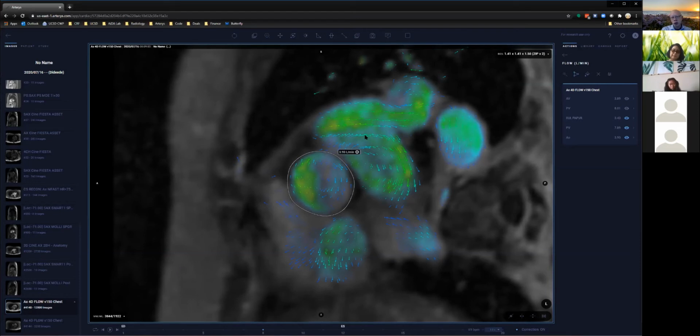It's really the measurements of shunt volume, shunt fraction, regurgitant volume that people are getting those. So I don't mind spending 10 to 12 minutes early in my scan to get a really good 4D flow, and then I don't have to worry about looking at the rest of the scan because I've got all the information that I really need. So instead of spending only 2 minutes on something that's really important, spending 10 to 12 minutes on what's important and then deferring the rest till later has been our strategy.